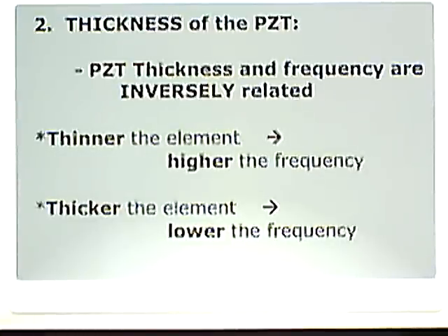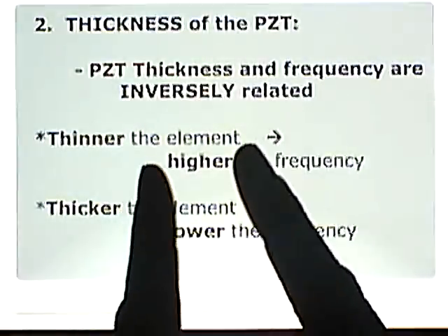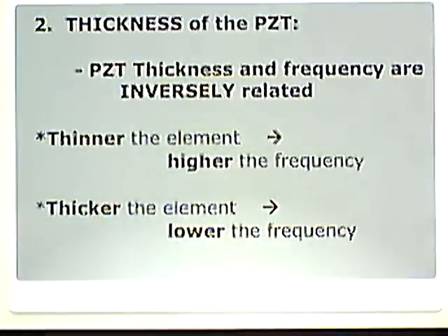If you have a thinner element or thinner crystal, you have a higher frequency. If you have a thicker element, you have a lower frequency.